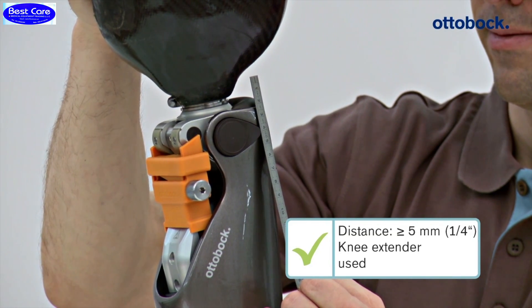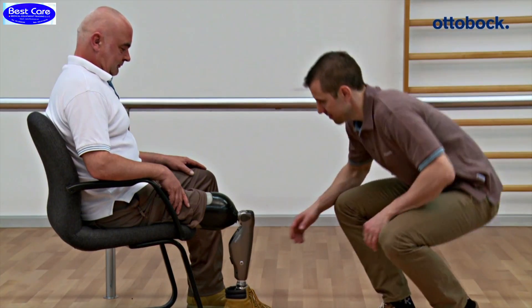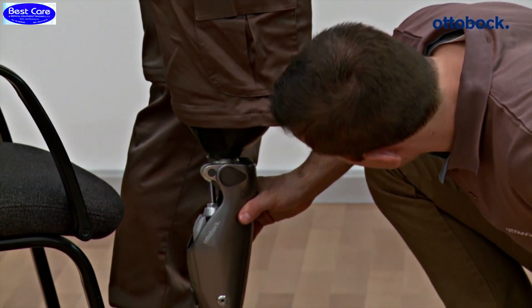This is the case here. Finally, the constructed prosthesis is checked once more on the user for sufficient distance under a load in a static situation.